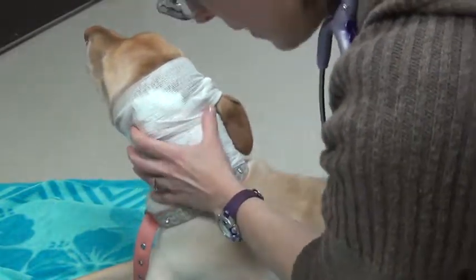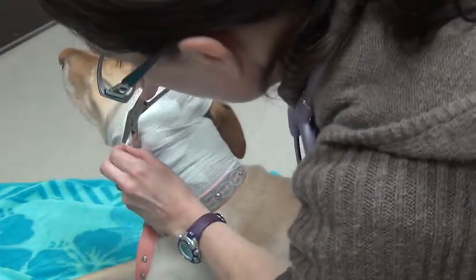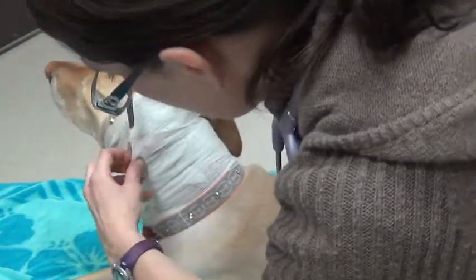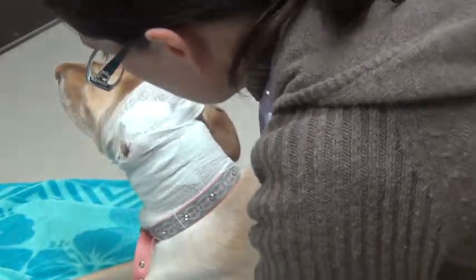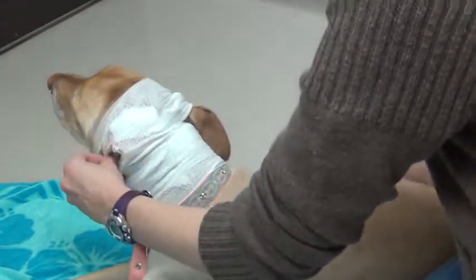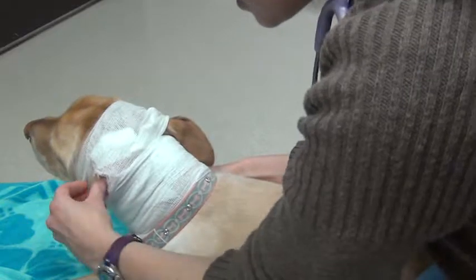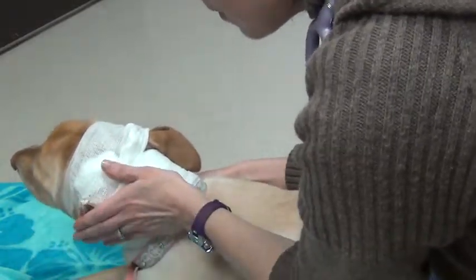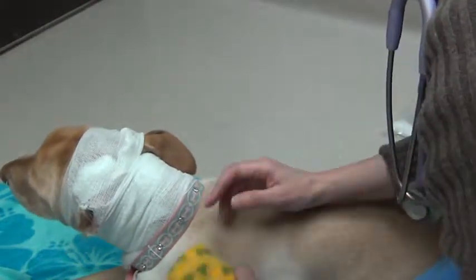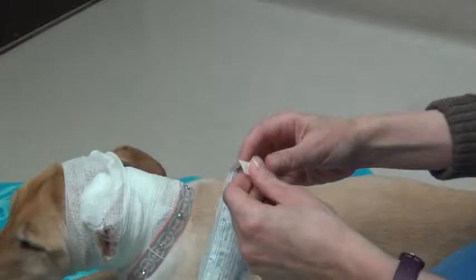Okay. The next part we're going to do, we can go ahead and cut an ear hole. You got to be really careful, just pick up only the bandage. Don't run into that ear. You got to be really careful to avoid that. So I did cut a little hole, and this is to actually, if we need to go in and medicate the ear, but it's also mainly just to protect the ear from getting cut whenever you go in and do things. Okay. So we can go ahead and apply another layer of the roll gauze.